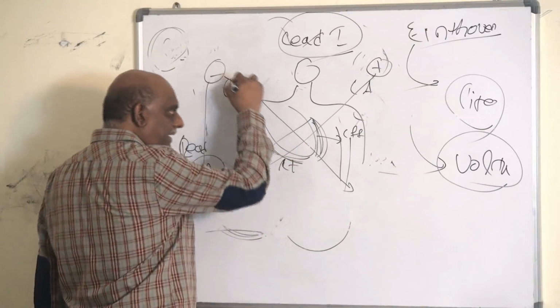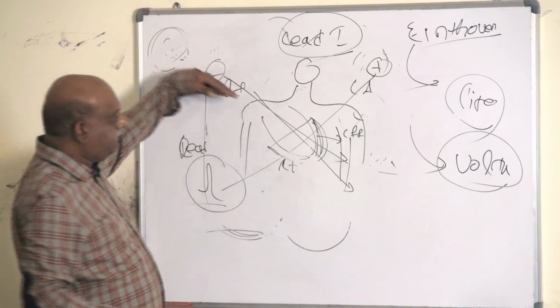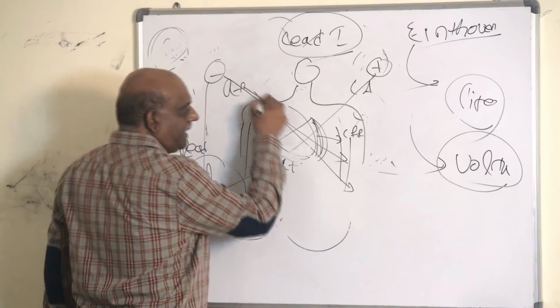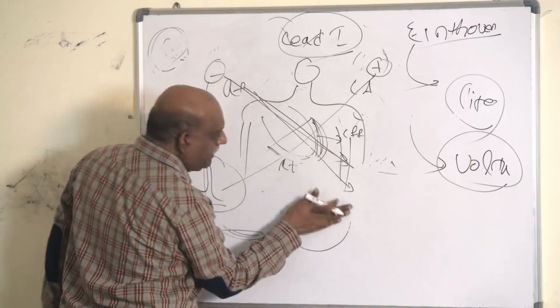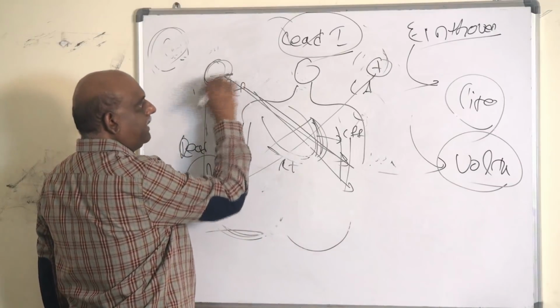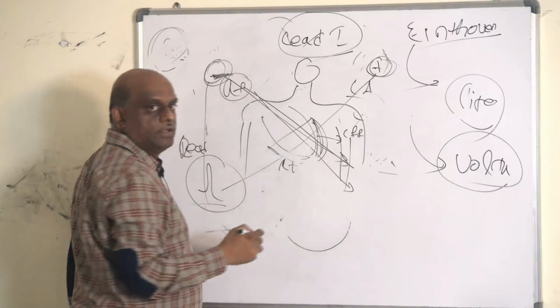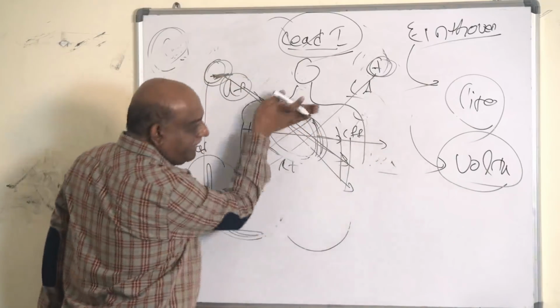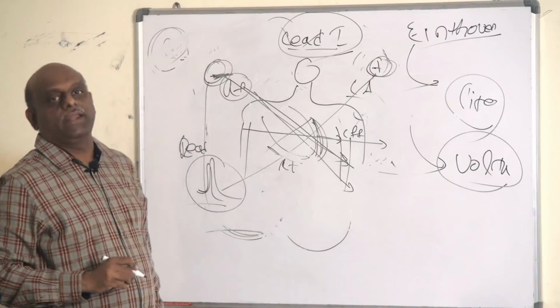So, entire electrical activity is passing towards the left side after originating from the right atrium and passing towards the left side. And since the axis of this normal electrical activity of the heart is above to below, from the right towards left, an electrode connecting the right arm with negative, left arm with positive, which is called lead 1, the electrical activity is passing towards the left side. So that is the reason the lead 1 will show a positive QRS.